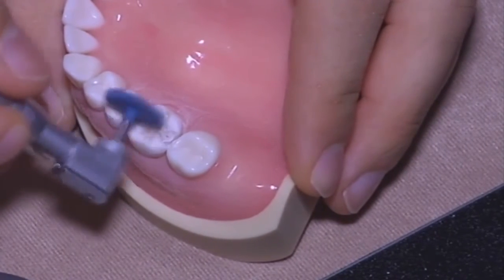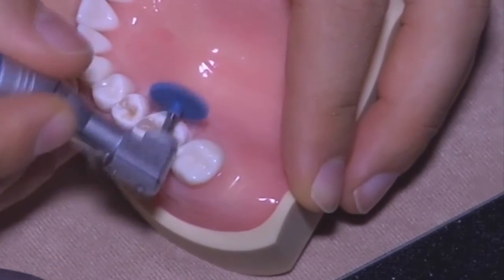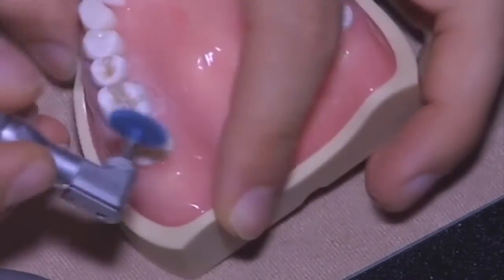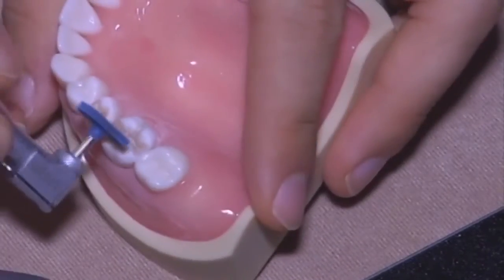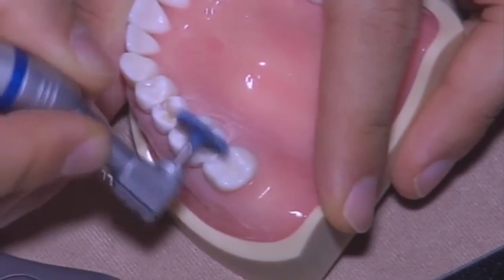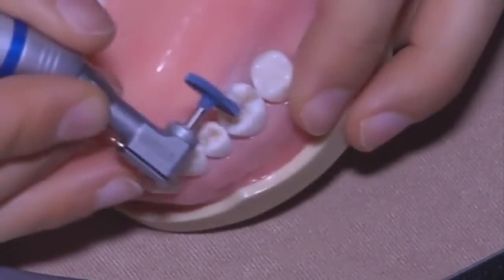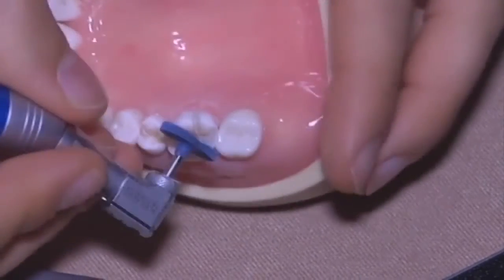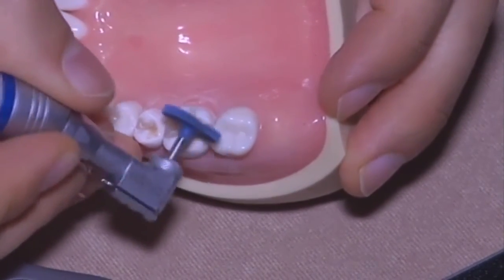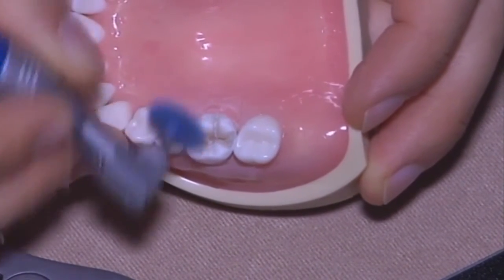You have two colors. The first one is more aggressive, to remove the excess and start cleaning. So this one has a more polishing result.